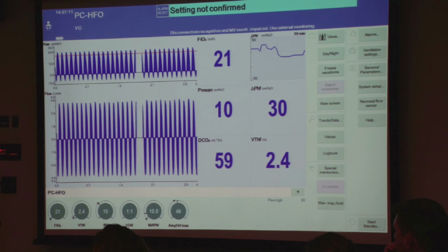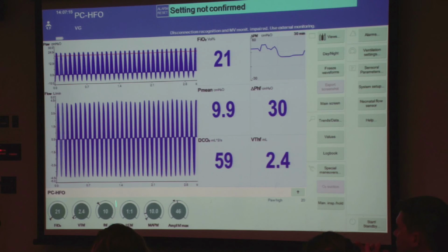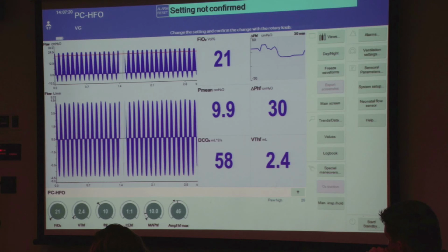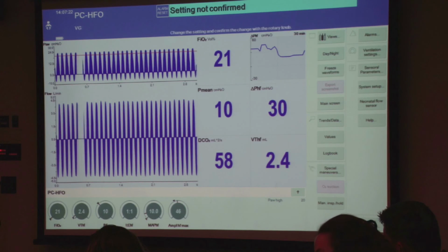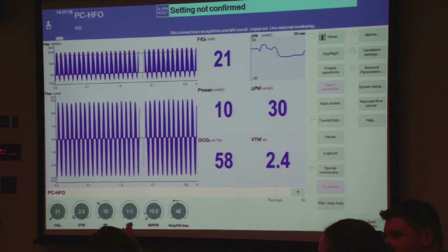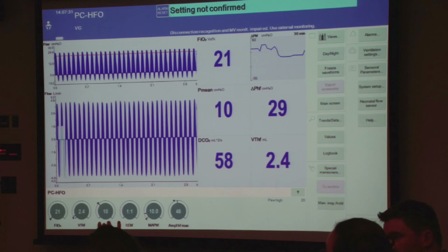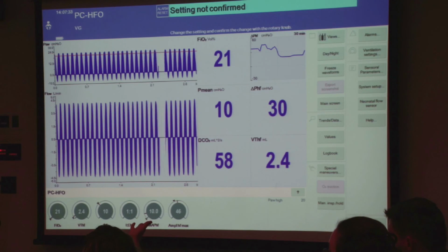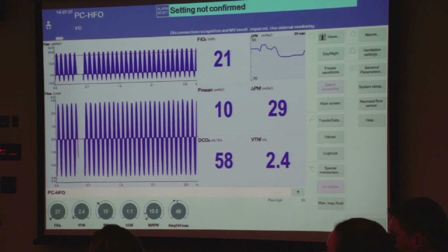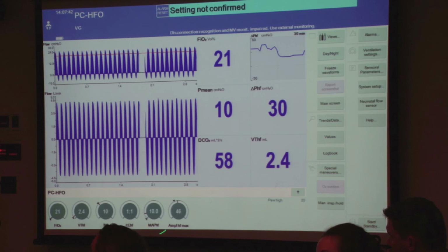And I think the protocol warns you about that when you're modifying anything here, you could have changes in DCO2 and no changes, obviously, because you're on volume guarantee in VTHF. Can you speak to also, during the protocol, you can wean them out. When you're weaning, you don't want to forget about that. That's also a variable. You don't stay at 10. No. You're talking about the mean airway pressure.